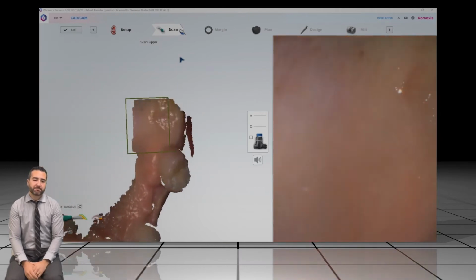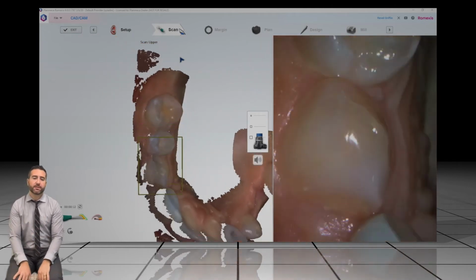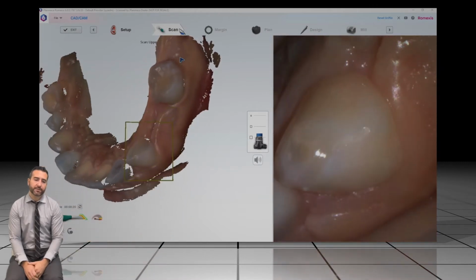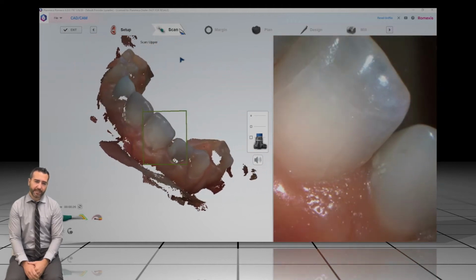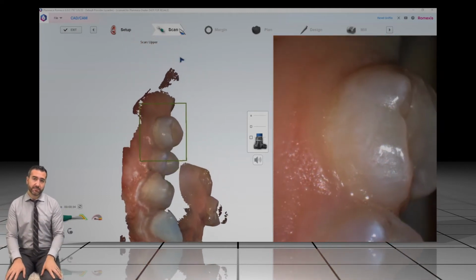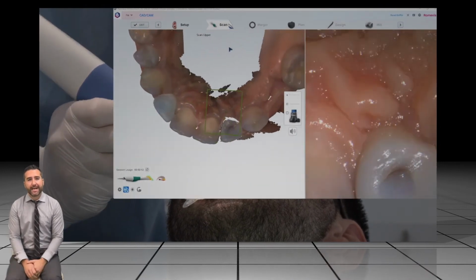So here we could see this particular patient needs a few implants. They need a smile makeover. So we're just going to do some diagnostic impressions. And all the scanners are going to have this kind of high-speed rotational based scanning with full color, okay? There's not a scanner really on the market today that's not going to be able to accomplish a very fast scan, a nice color scan, and more importantly, one that's really accurate cross arch, right? Because we need these to be super accurate and very easy for the clinician to do or team member to do as well.